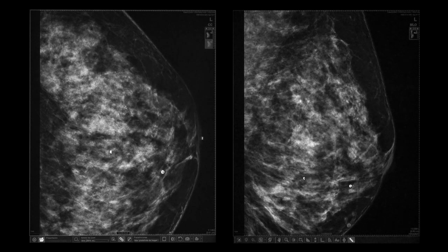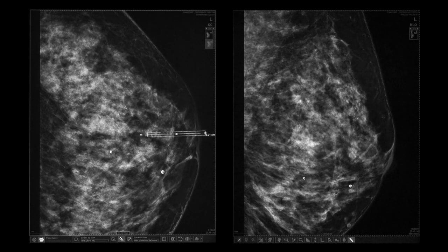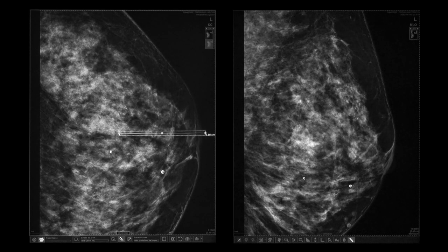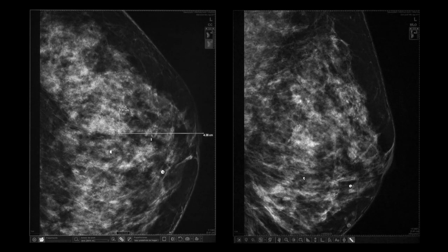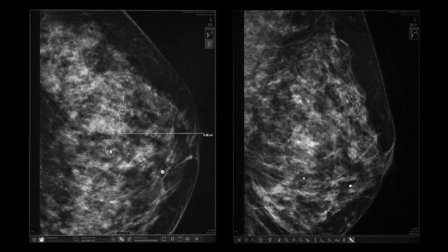In the cranio-caudal view, draw a straight line from the nipple to the chest wall — this is 4.38 cm — and a perpendicular one from the lesion to intersect with the first, which is 1.31 cm. These measurements will be replicated in the breast to ease positioning.